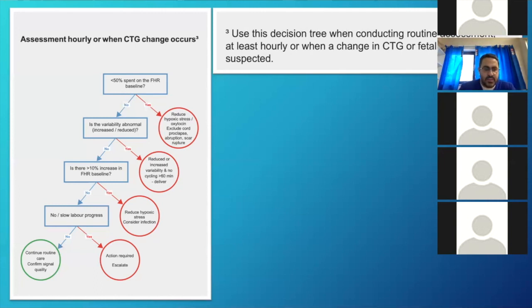Okay. Yeah, because that's what I was saying on my nights, but they said you need a minimum of 3 in each box, sometimes 5. No, the normal is, somebody or a baby that has a heart rate of 120, you would get a cross every 30 beats, which means you would usually get 4. Somebody who has a heart rate of 150, you would probably be getting 5.